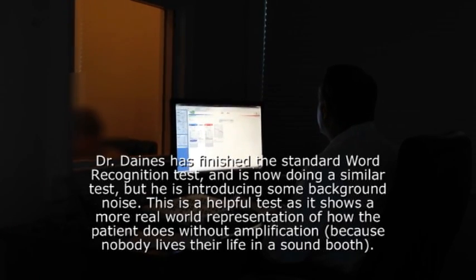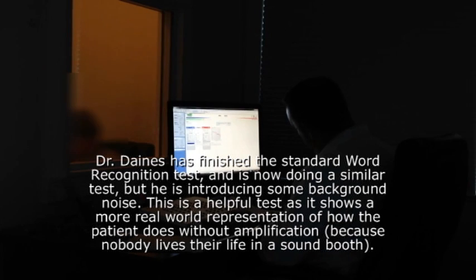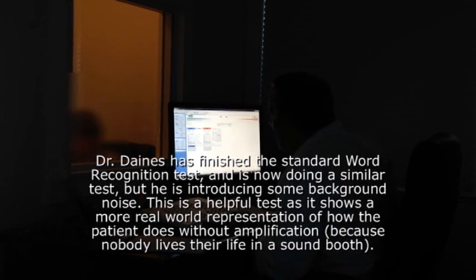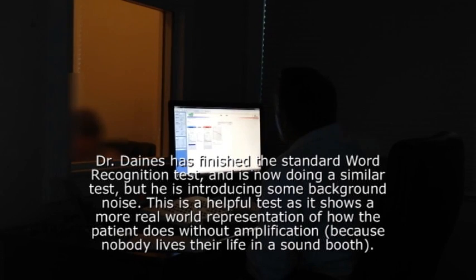Okay, for this next test, I'm going to make it a little bit different. It's still words again, but I'm going to turn the volume level down just a little bit. And I'm going to put some noise into the opposite ear. I'm going to make it a little bit hard for you here. So, just make your best guess at what the word is. Here comes the noise.